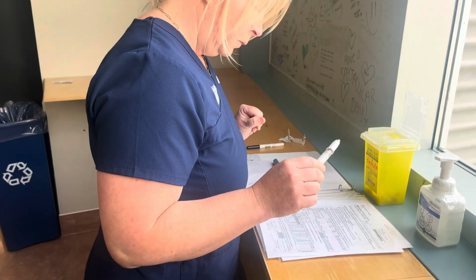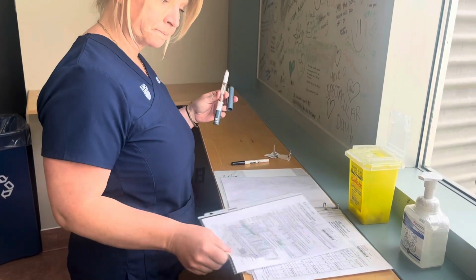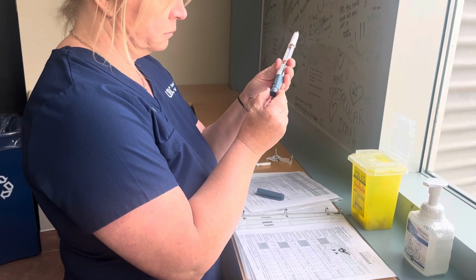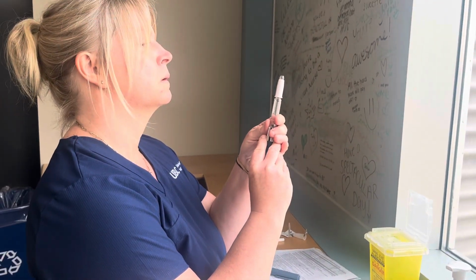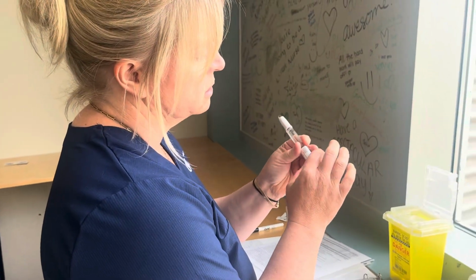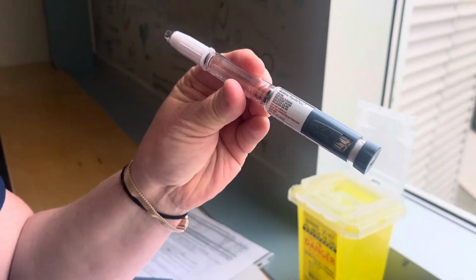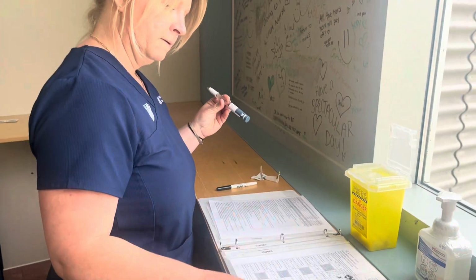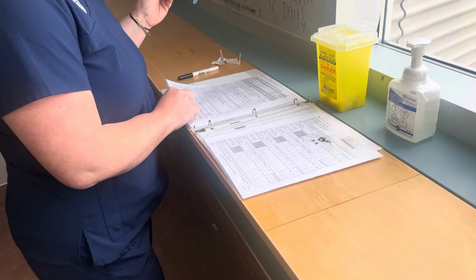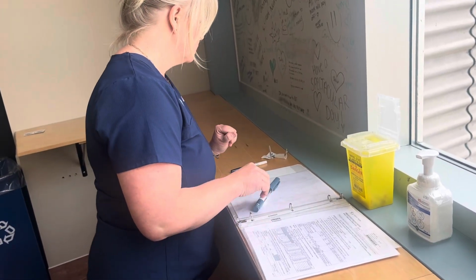I'm going to prime this little guy. Prime it with 2. Great, that's good. I'm going to set the dose for 3 units. I'm going to have my RN give that another independent double check to make sure she's happy with that. And again, that's documented there for the independent double check. Okay, we'll recap that. We're going to head into our patient's room.